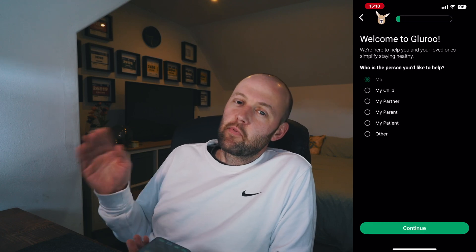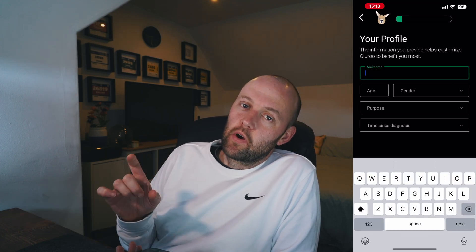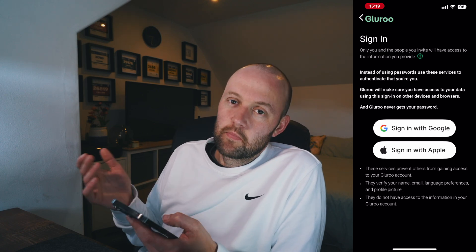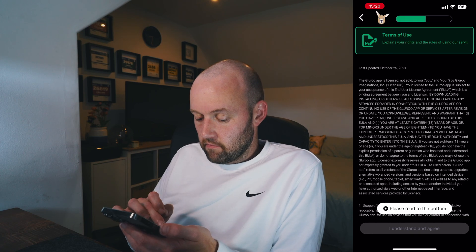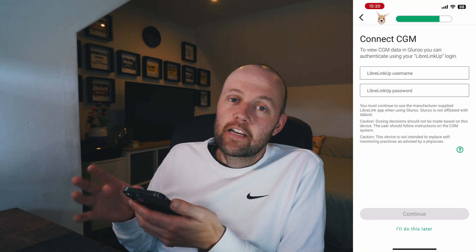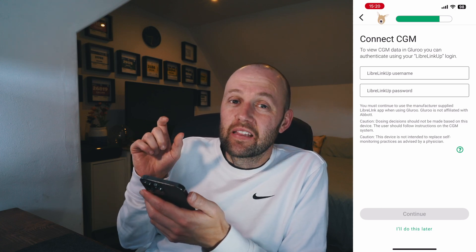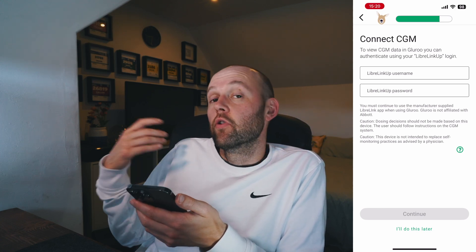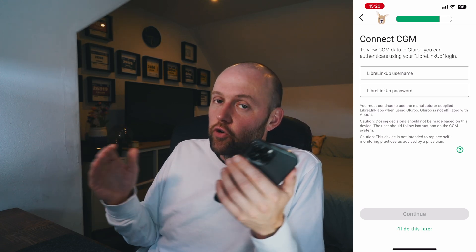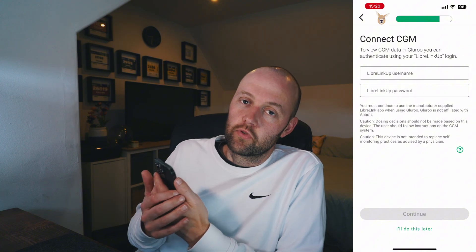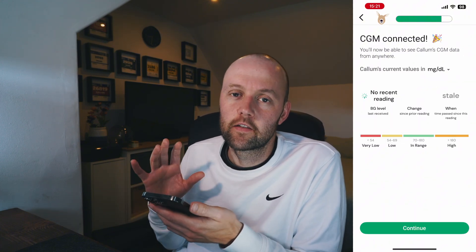Once you've downloaded the app, you're going to want to set up your profile. There are various things you need to fill in, like your name, your age, why you want to use it, etc. Just keep filling that out until you get to the Select Your CGM part. Then you'll get to the end screen where you can actually sign in. I'm just going to sign in with Google because I've got a Google account — it's a bit easier for me. So I'm going to press Continue and Begin. Now I'm going to connect my CGM. If you're a Libre user, you use your Libre Linkup account and password here. If you're a Dexcom user, you just use your standard Dexcom email and password here. Then it should connect up to the cloud using either of those.